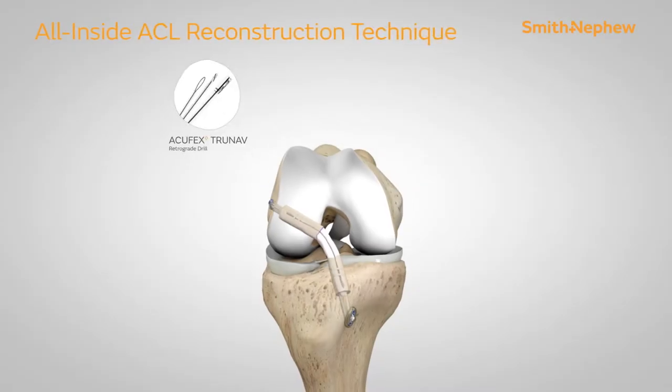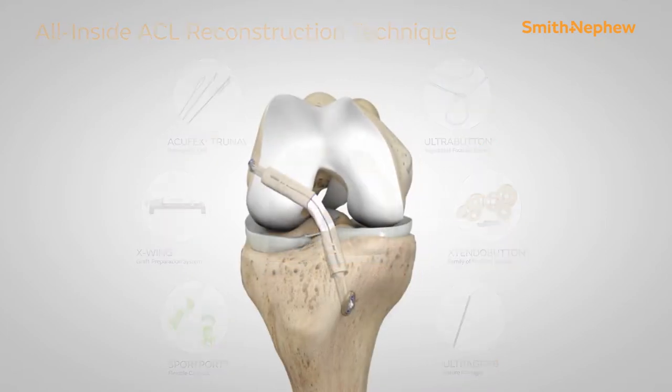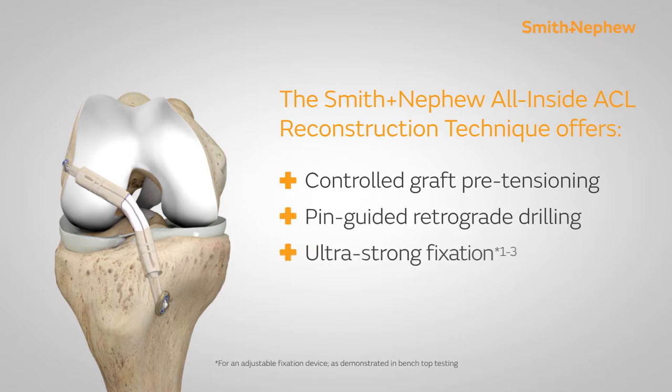Smith and Nephew's All-Inside ACL Reconstruction Technique. This technique offers controlled graft pre-tensioning, pin-guided retrograde drilling, and ultra-strong fixation.